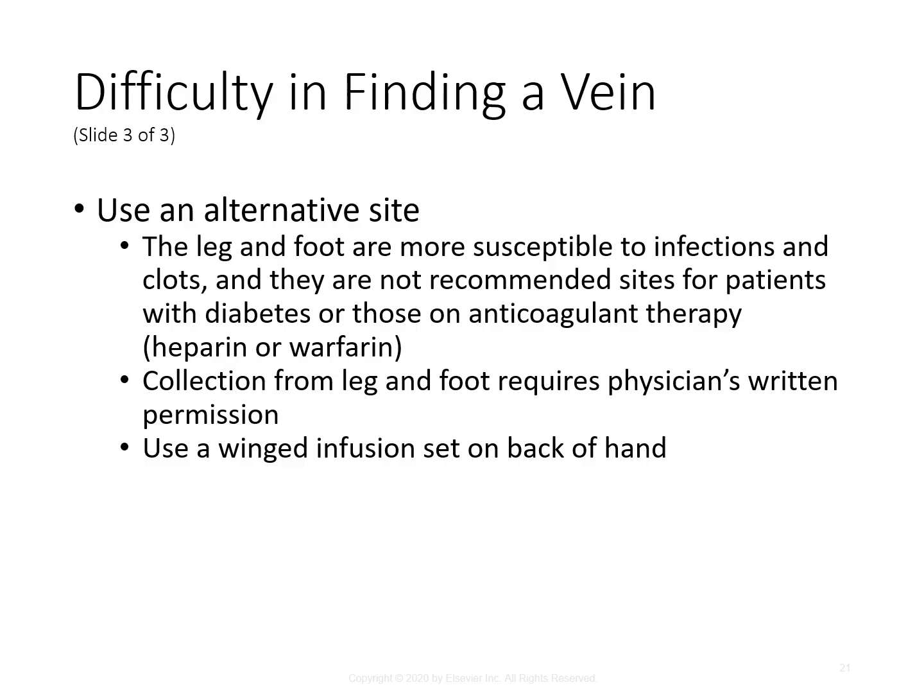physician for. If you are able to do it from a foot or a leg, you will use a winged infusion or a butterfly set to collect that. And another option is you can draw with a butterfly or winged infusion set as well on the back of the hand.